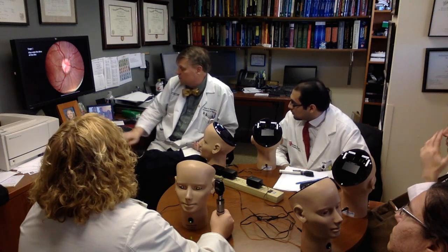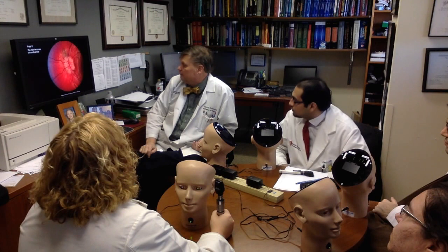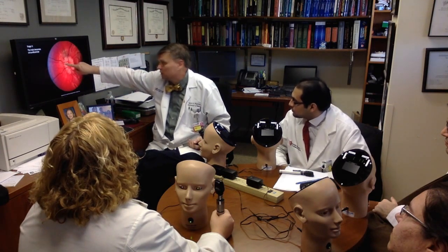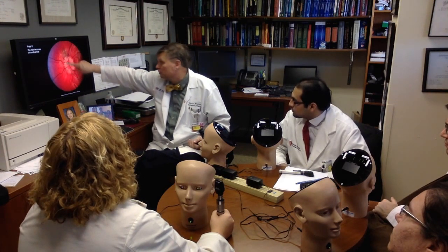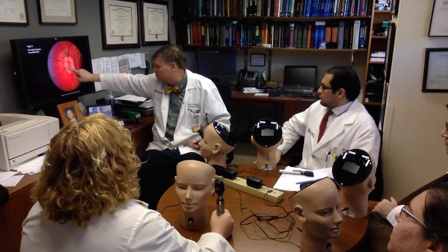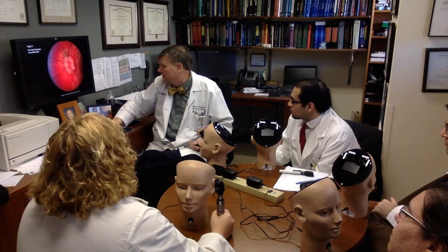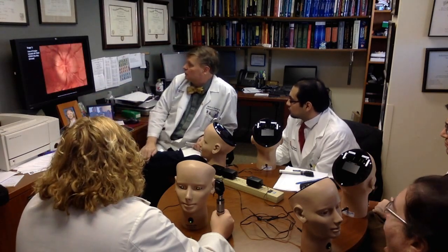Now, let's look at this one. Oh, sorry, there's the down the hill thing. This one's grade 3, all right? It's actually now blurred on the temporal side. It's blurred all the way around, and this whole thing is elevating. Look at the blood vessels here. Down the hill, out it goes.